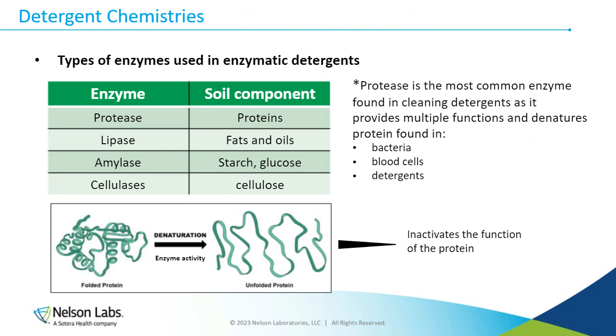Now, the detergent chemistries: you will see that there are different types of detergents, and they all have different types of enzymes depending on what the target of that detergent is. But this is just a visual demonstration of all these different enzymes that are in detergents that you may have never thought of when you're doing these validations, something to give you a visual of what kinds of enzymes we're looking at when we talk about detergents.